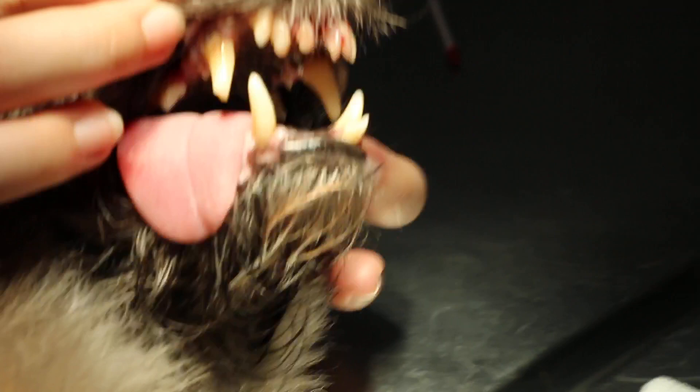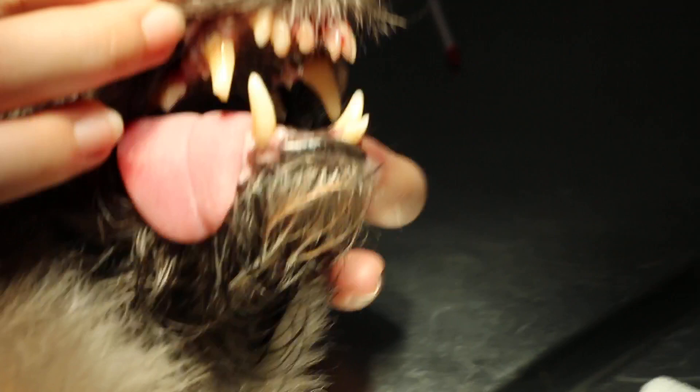We will just show the machine. Hold the head up, turn a bit to the side here. This is the one. We will stop first and then just excise.